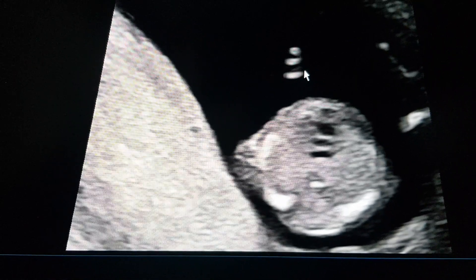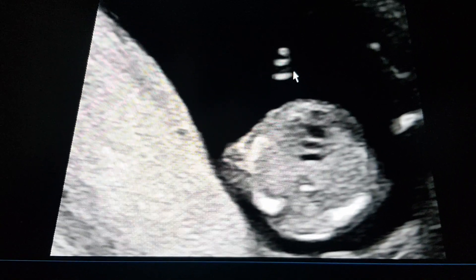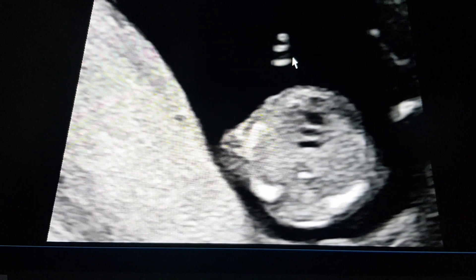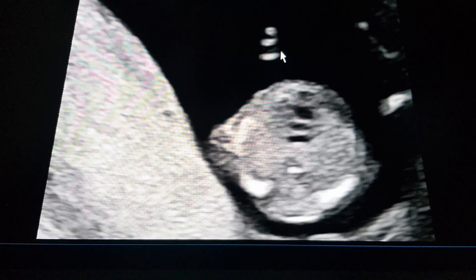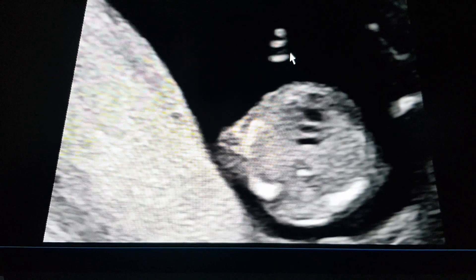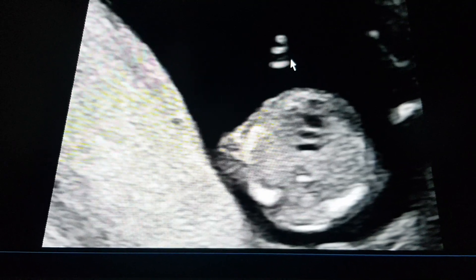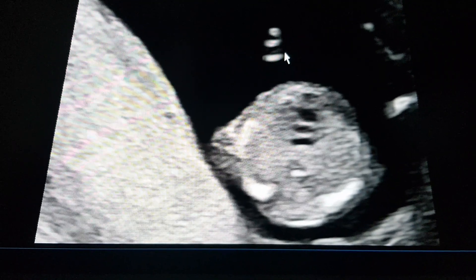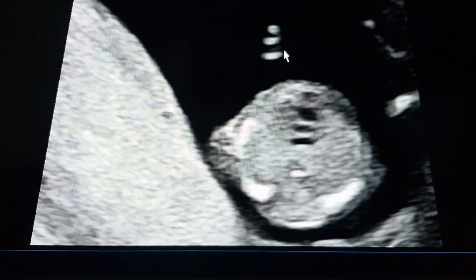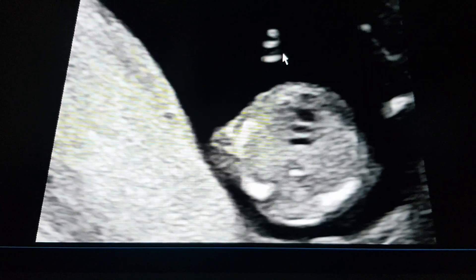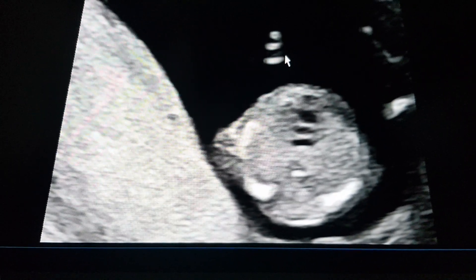So this is a short video showing that at the first trimester, as part of the first trimester anomaly scan, it is important to assess the umbilical artery and whether there is a single umbilical artery, and how one can mistake an external iliac artery for an umbilical artery in a case of single umbilical artery. Thank you very much. Dr. Pradeep Srinivasan from Bangalore - happy learning, Jai Hind.